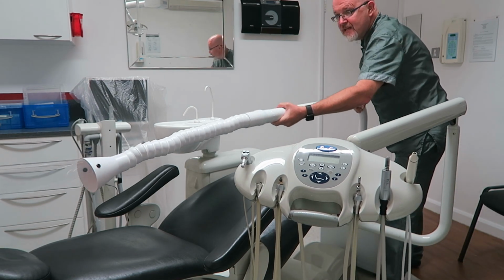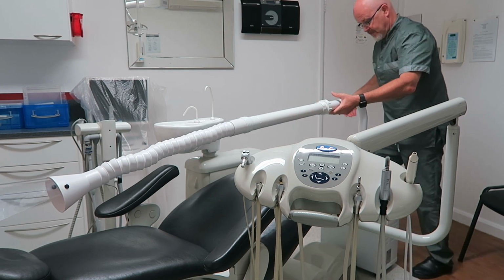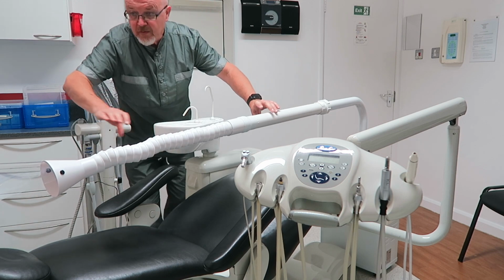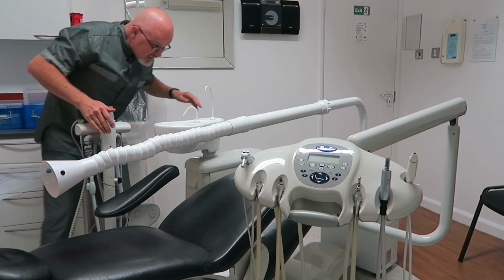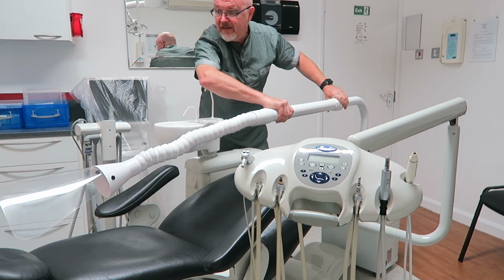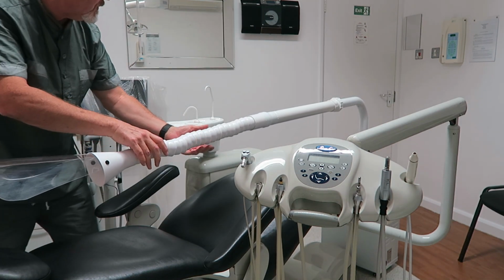Just the bottom of the chair. Oh, I mean, look at that. I suppose that's about the maximum reach. So, yeah, and the unit's still stable, and that can come up there. I know my chair is around about 2 meters long, so got over 2 meters worth of reach here, so probably 2 meters 10, 2 meters 20 in total. For my situation here, I just need to pull this back a bit. And there we are. There we have it.